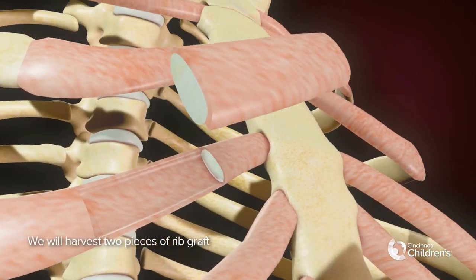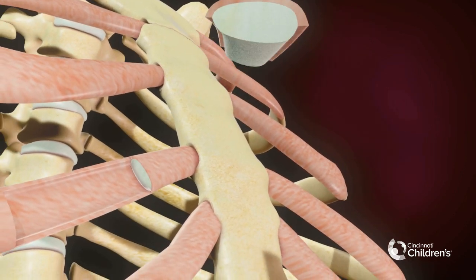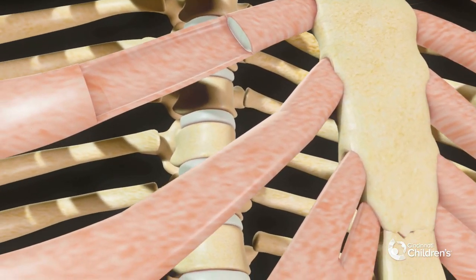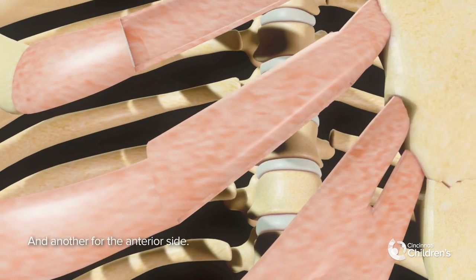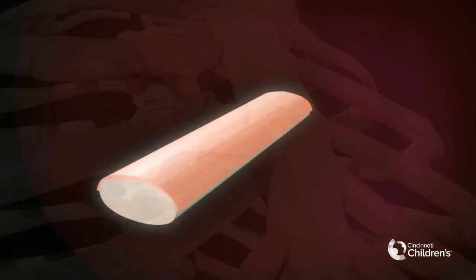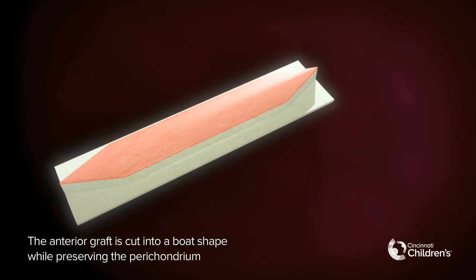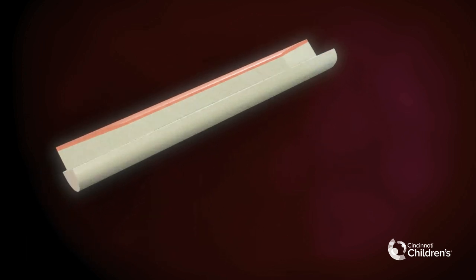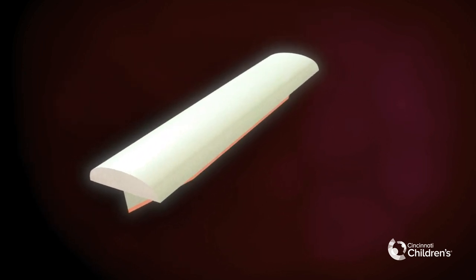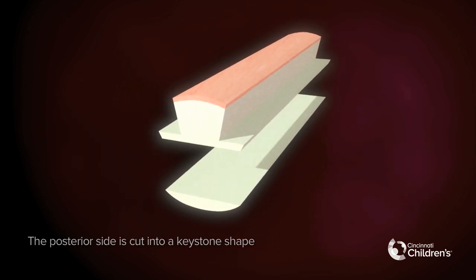We will harvest two pieces of rib graft: one for the posterior side and another for the anterior side. The anterior graft is cut into a boat shape while preserving the perichondrium. The posterior side is cut into a keystone shape.